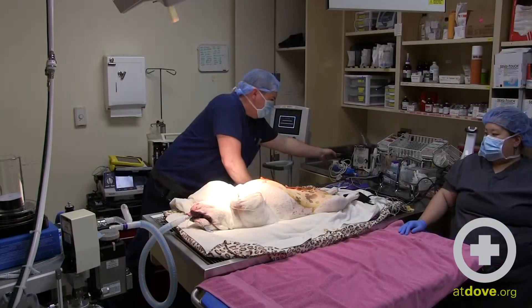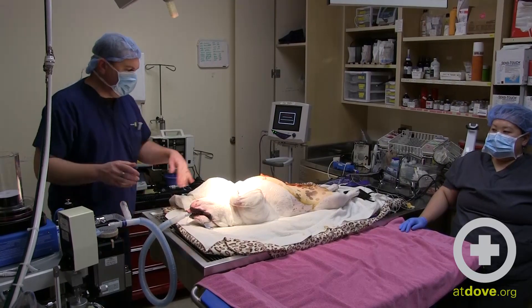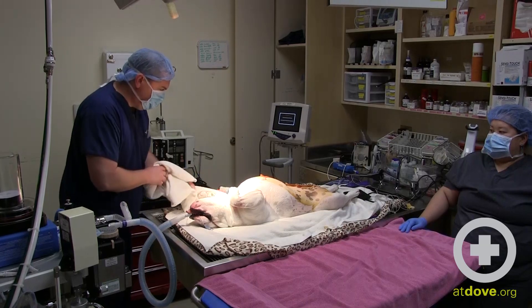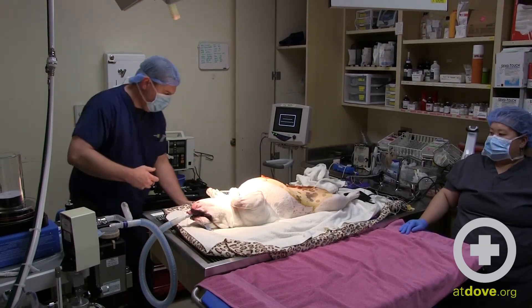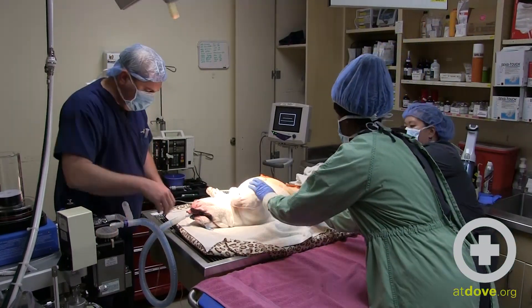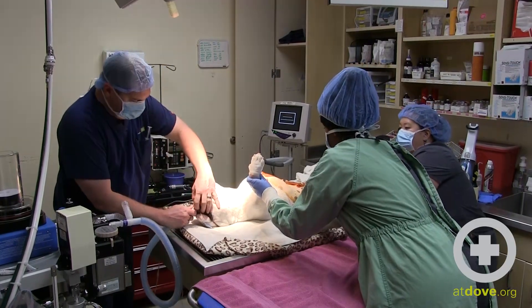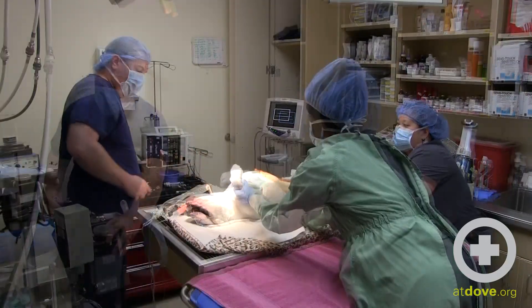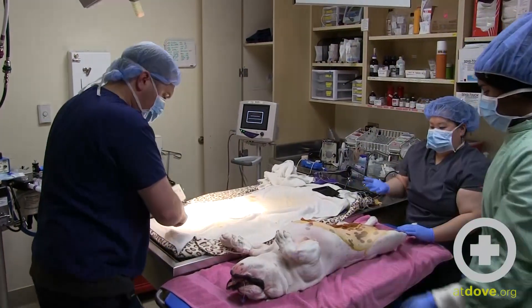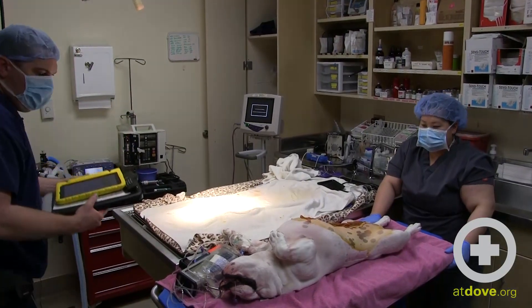The last thing I'm going to do is detach her from iso and oxygen — we need to keep her anesthetized as long as we can since we're moving into another room, so that'll be the last thing we do. Are you guys ready to move her? Go ahead and turn off our oxygen and our gas, and before we move her, always remember to detach from your breathing tube. Okay, we're ready to go.